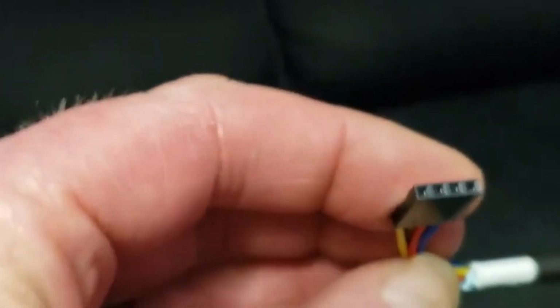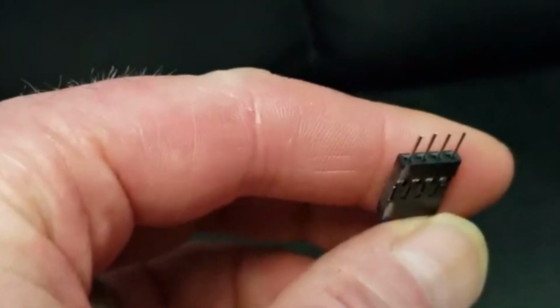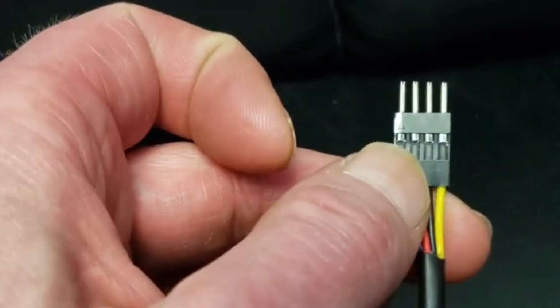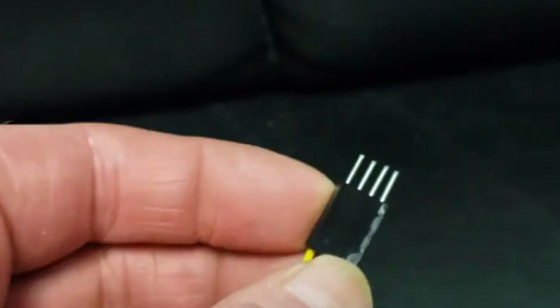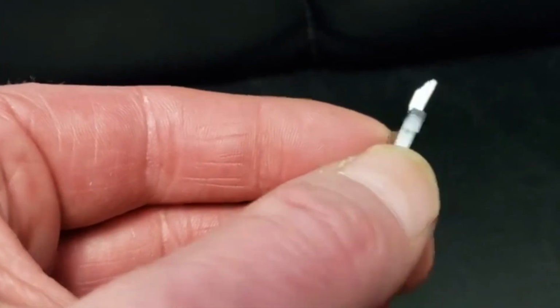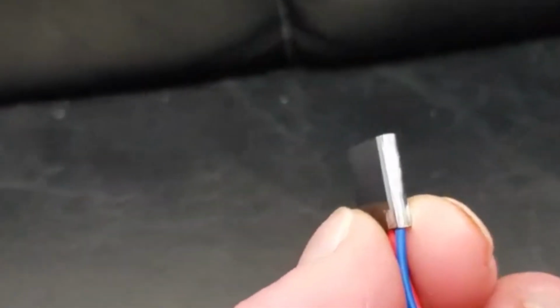which is the other side here. This side is going to go into the circuit board. This side is going to plug into the motor. Now it doesn't lock. That's not good, but it's not going to come off. And besides not locking, it's also not polarized. So in other words, you could put it on backwards by mistake. That's why I took a little gray Sharpie and I colored the blue side on this end. I colored the same blue side on the female end.